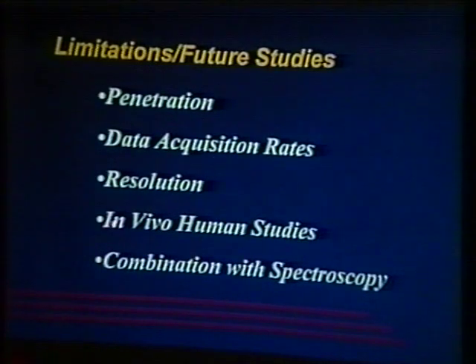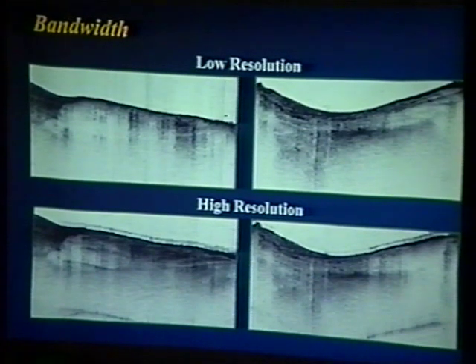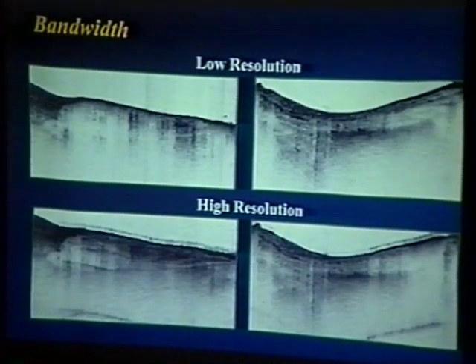One of the current modalities we use is a scanning optical delay line, which was developed by two students who were in the lab at the time, Brett Bouma and Gary Tearney. And it's really very cute in a lot of ways. Light from the reference arm is shined on a grating. The light is then shined on a tilted mirror. The Fourier transform of a linear phase ramp in the frequency domain results in an optical group delay in the time domain. The light is reconstituted on the grating, and by changing the angle of the mirror, you change the optical group delay.